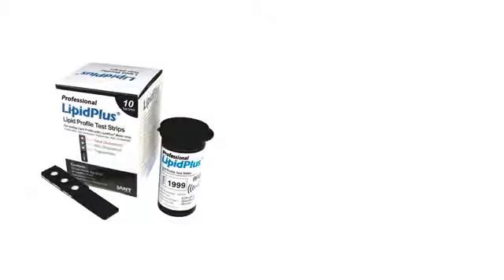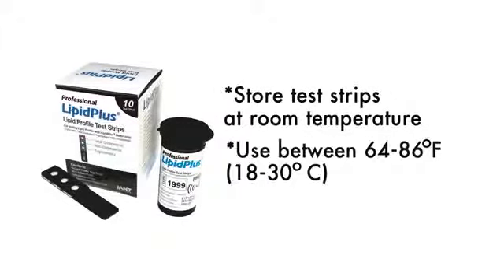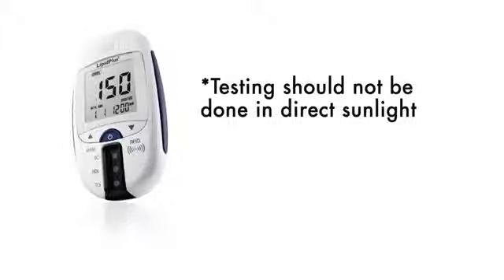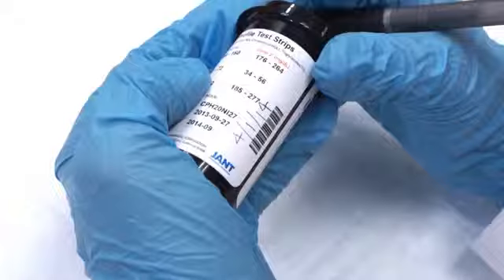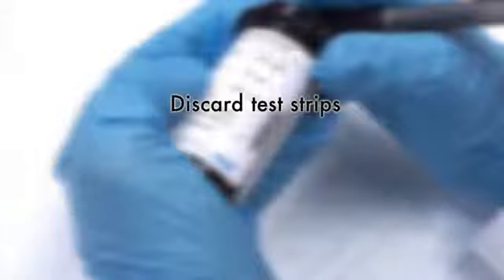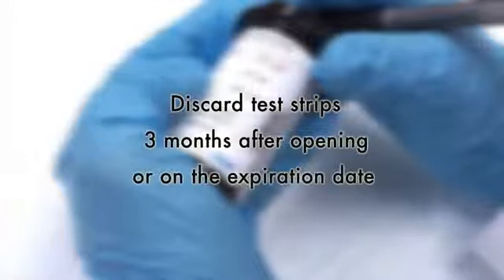The LipidPlus lipid panel test strips can be stored at room temperature. They should be used at a temperature between 64 and 86 degrees Fahrenheit and a humidity between 10% and 90%. Testing should not be done in direct sunlight. When you open the bottle for the first time, write the date on the label. Any remaining strips should be discarded 3 months after first opening the vial or on the expiration date printed on the label, whichever comes sooner.